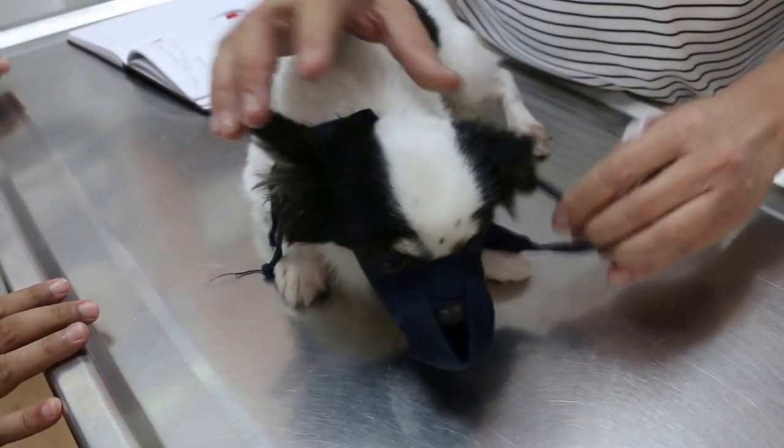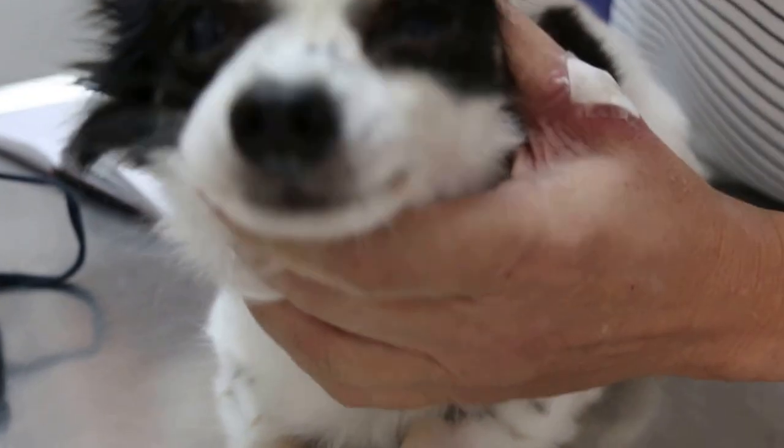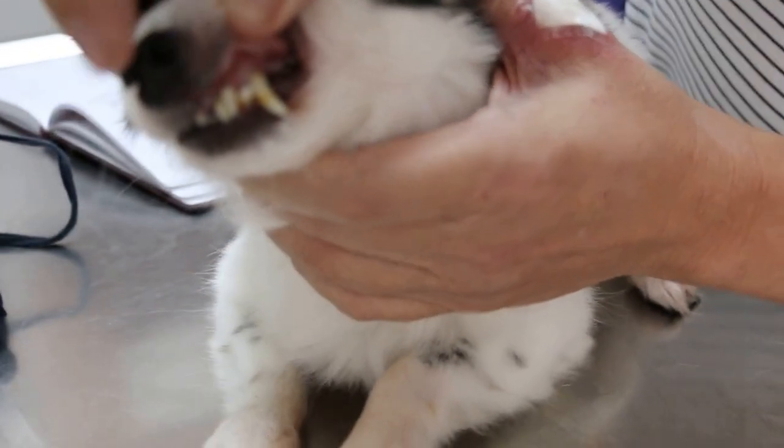The Chihuahua comes in actually for the dental. So I have checked the teeth. Now we can see it. It's been eating dry food. I don't need to go so close and zoom. So it's eating dry food.